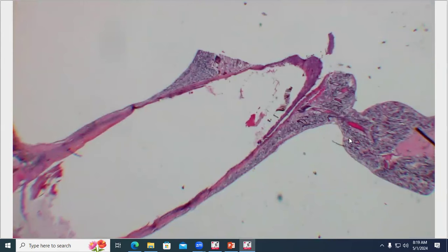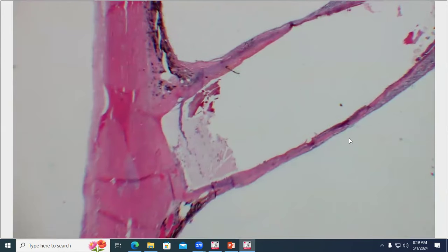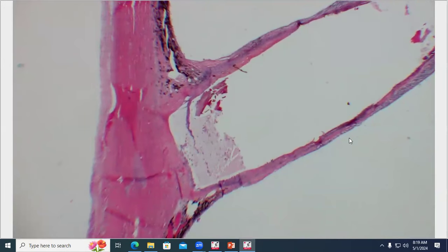Again, such a great example. For resident students, every time you see something exquisitely geometrical like this on histology, go back a little bit towards the sclera. See how squared up that is. Very few things in nature look that geometric, and nothing in the eye particularly. So it's a good suggestion that there was something there that shouldn't be there. Foreign body, or you see that a lot in the eye with intraocular lenses, like IOLs from cataract surgeries. Yeah, we'll get an example of that later.